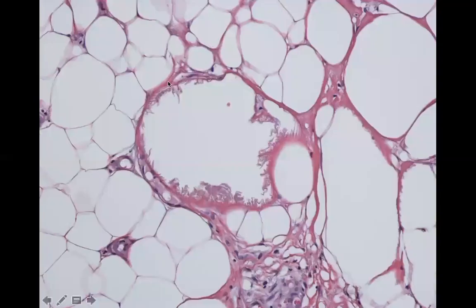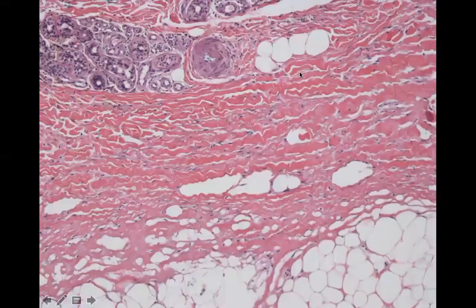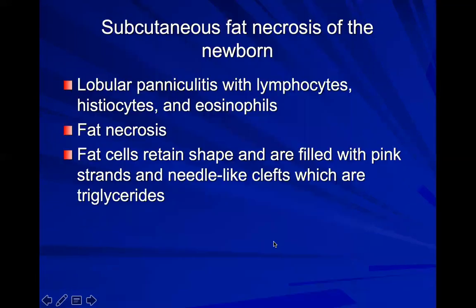And then if you go in even closer, you can see in the fat, as it's dying, it's getting these wavy little bits. It's been referred to as the arabesque sign because it reminded somebody of a ballerina with their leg sticking out in the back like an arabesque position. But regardless, whatever you see it as, it's this ribbony change in the fat cell wall that happens as it's dying. And that's pretty characteristic of lipodermatosclerosis. So here's the fibrosis and the sclerotic changes that happen. Here's another case and a close-up look at the lipomembranous change.